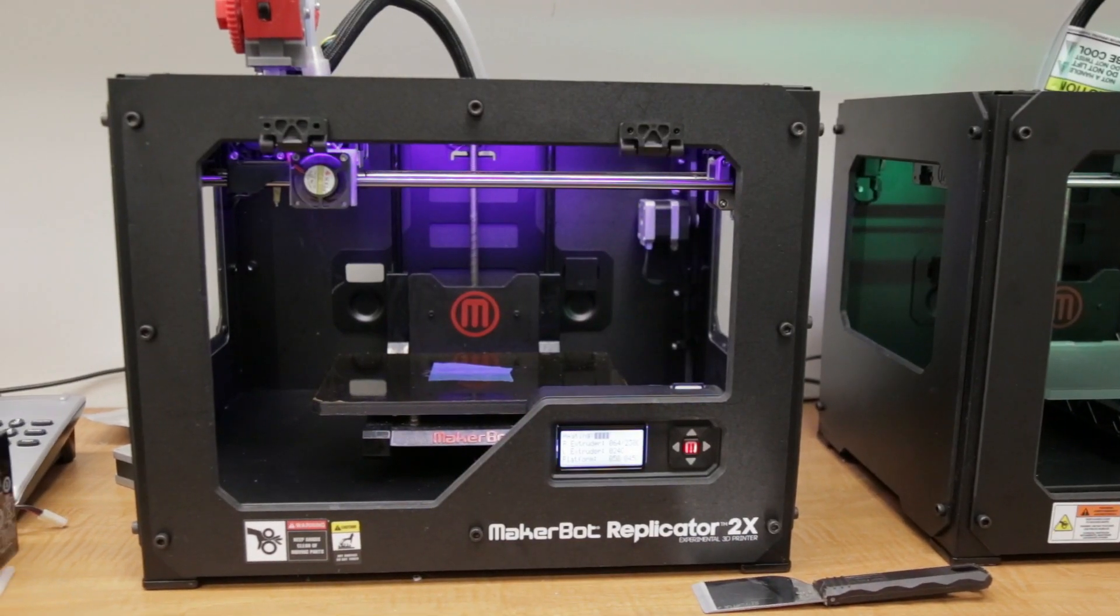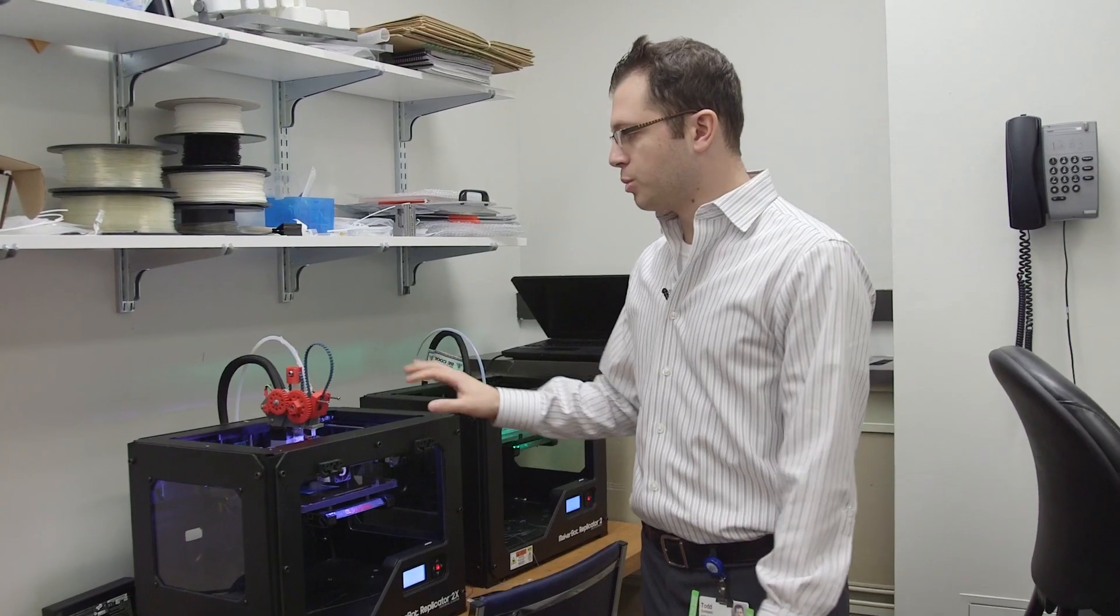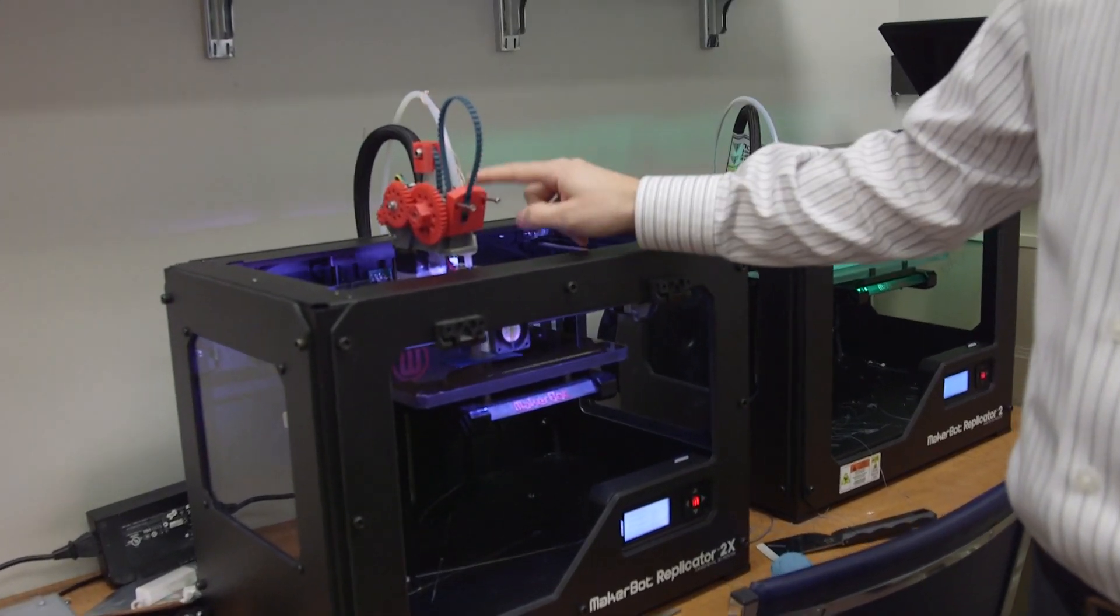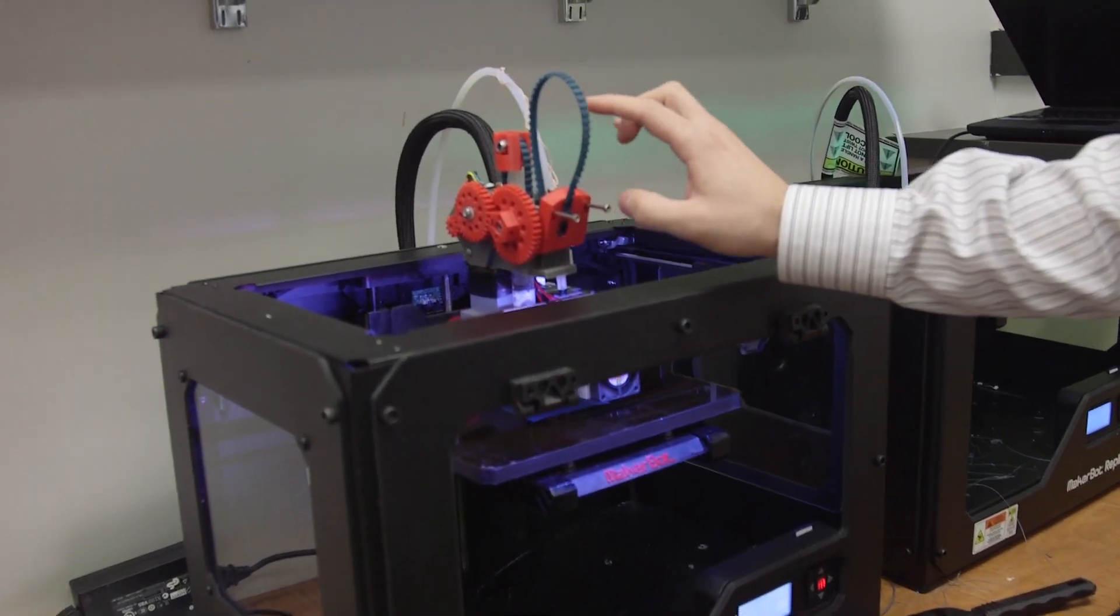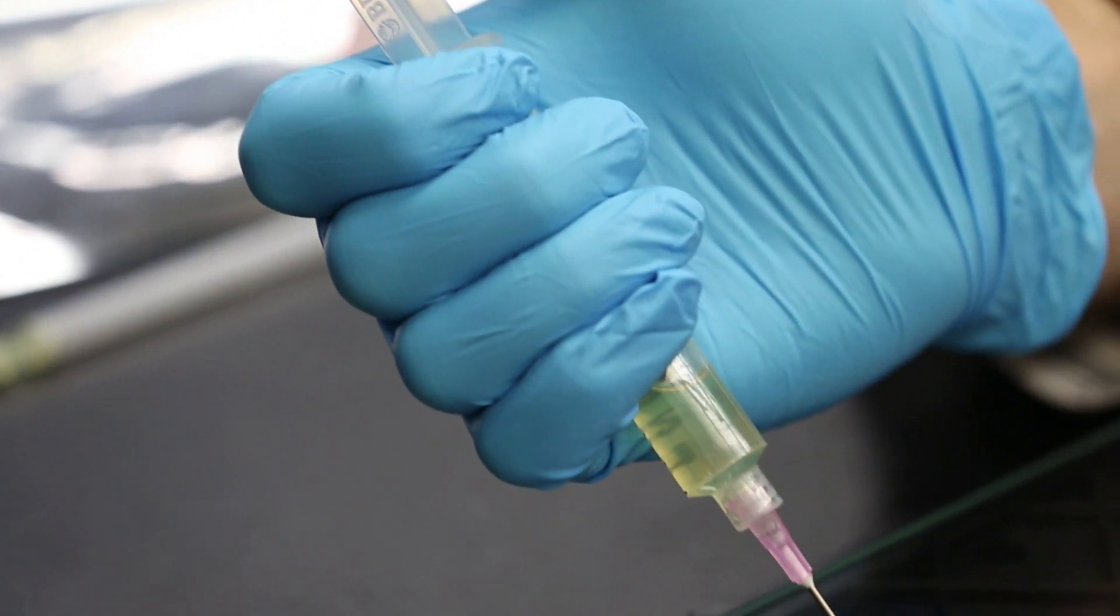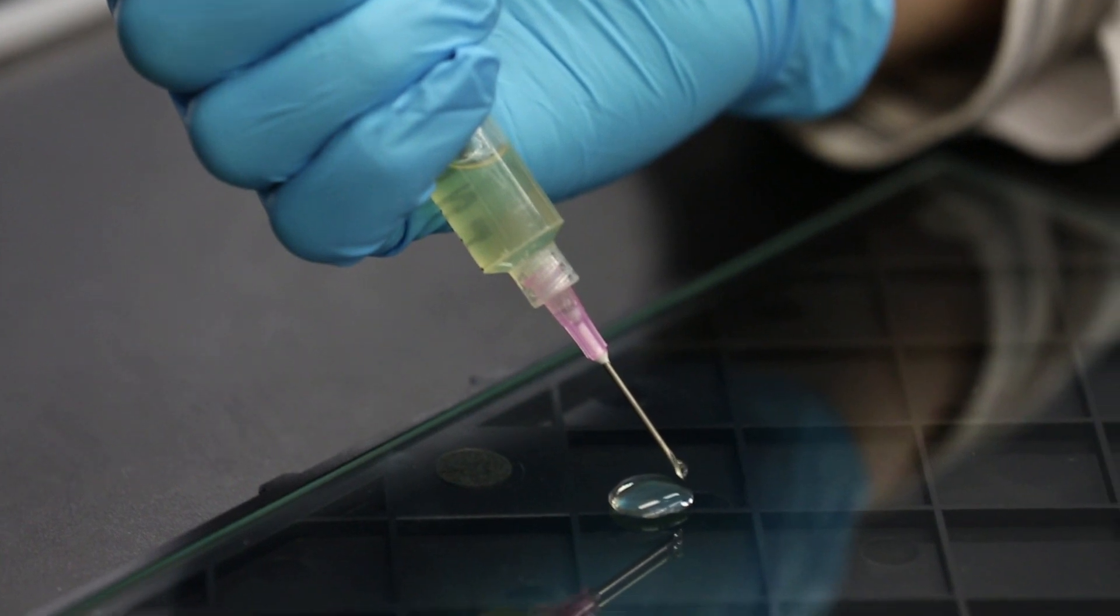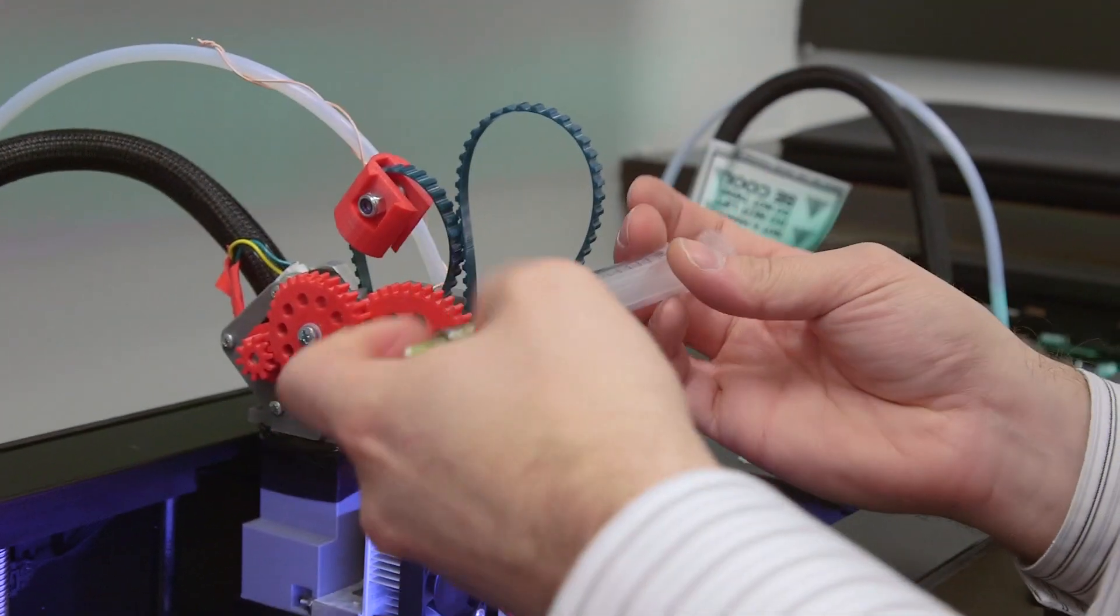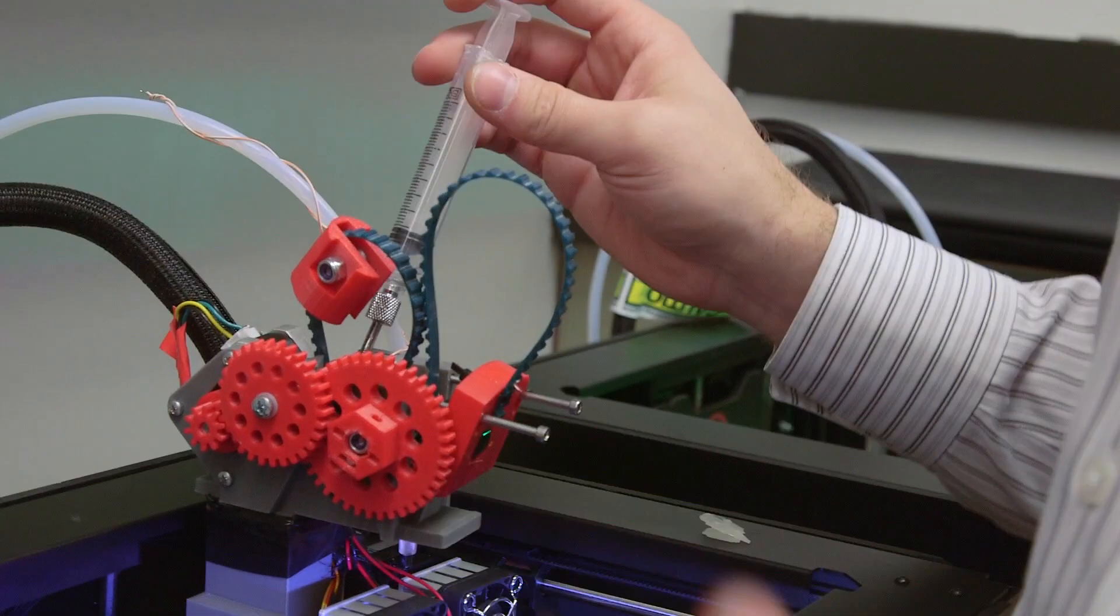This is the MakerBot Replicator 2X, and we've modified all of the extruder heads to be able to accept PLA and also to accept a syringe filled up with living cells and what we call bioink. So in the bioink is collagen, food for the cells, and all this type of media, and our chondrocytes, which are the cartilage-making cells.